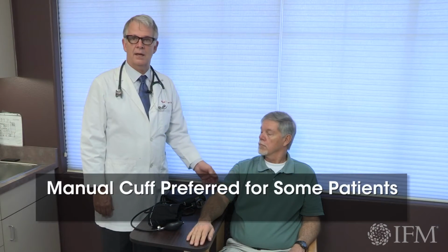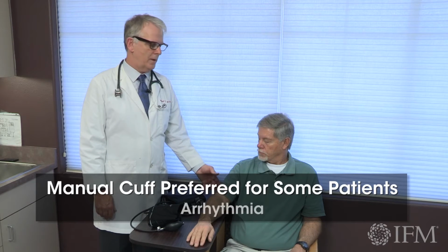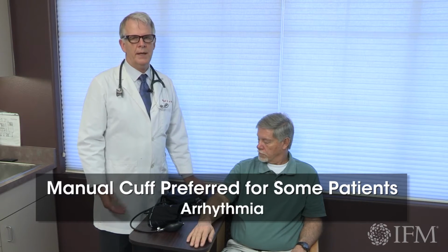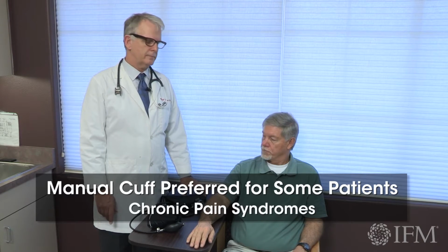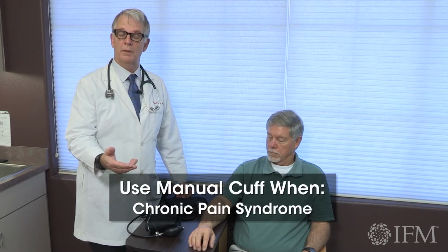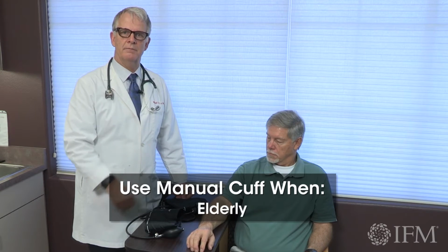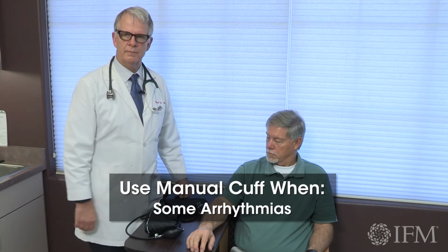Clinically, I've had a number of patients say it pumps up to 200 and never stops pumping up, and it's too painful. If you have somebody who has an arrhythmia, you really can't monitor it well with an automatic blood pressure cuff. If somebody has fibromyalgia or a regional pain syndrome, just the pressure of a cuff that won't deflate adequately quickly is painful. And that episode can actually linger in the nerve memory for a period of time. So in your fibromyalgia patients, it's better to do a manual cuff than an automatic cuff. Those are the reasons I use to help determine when I'm going to use a manual cuff or an oscillating automatic cuff.